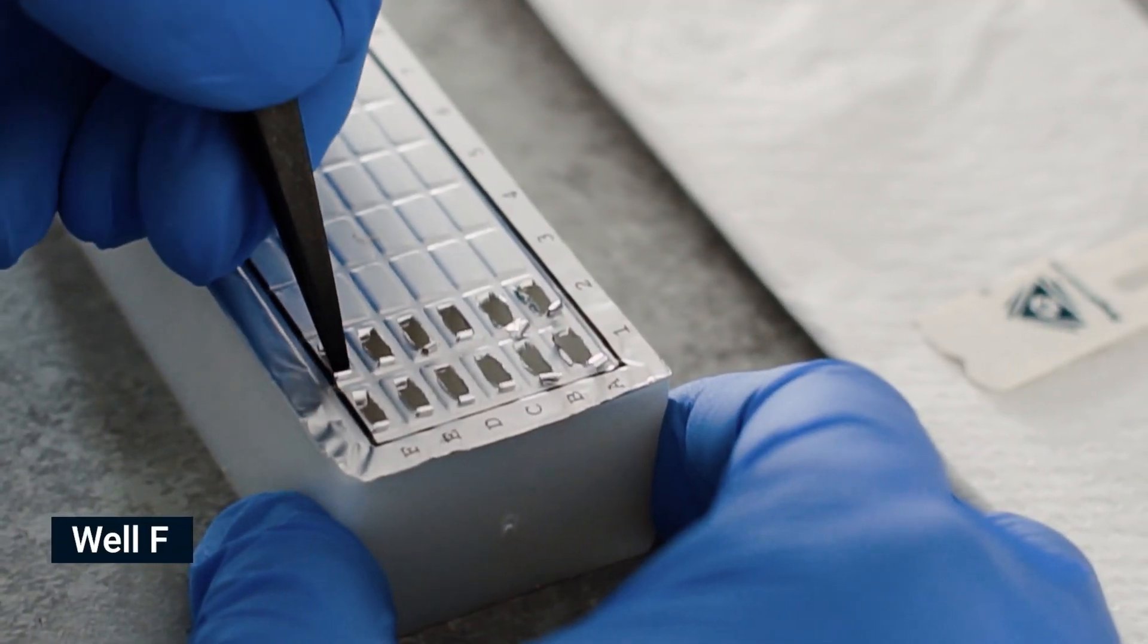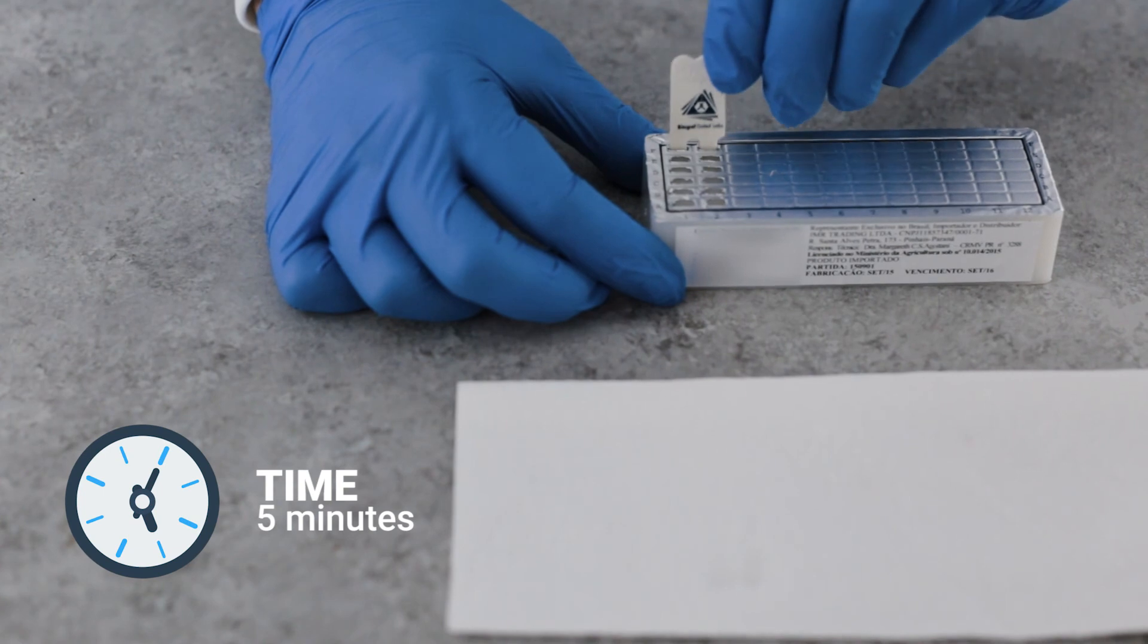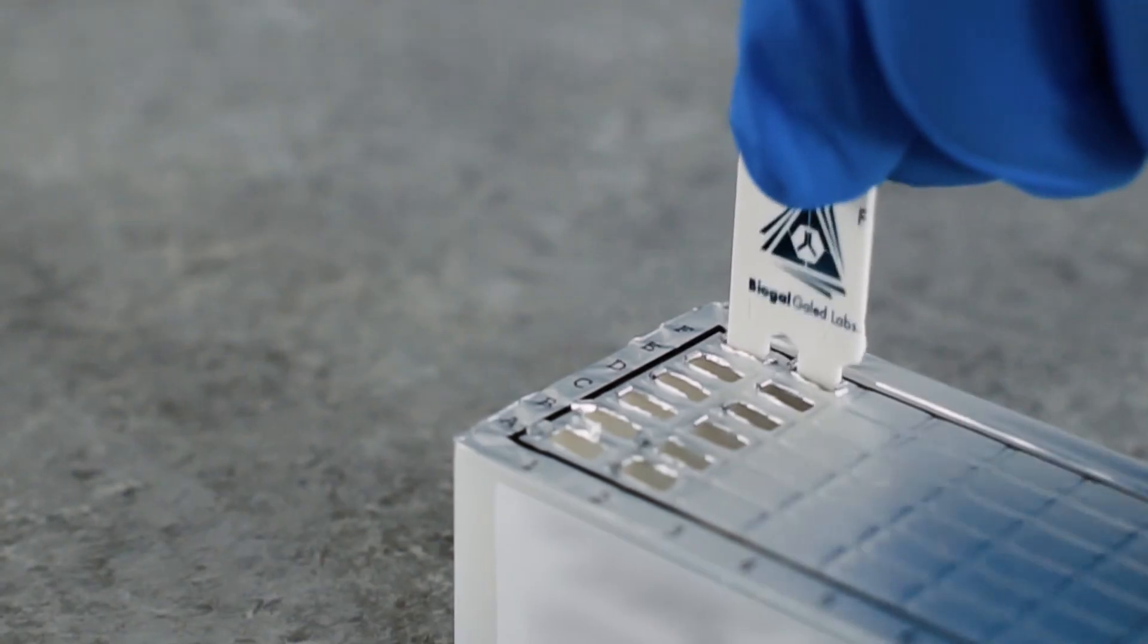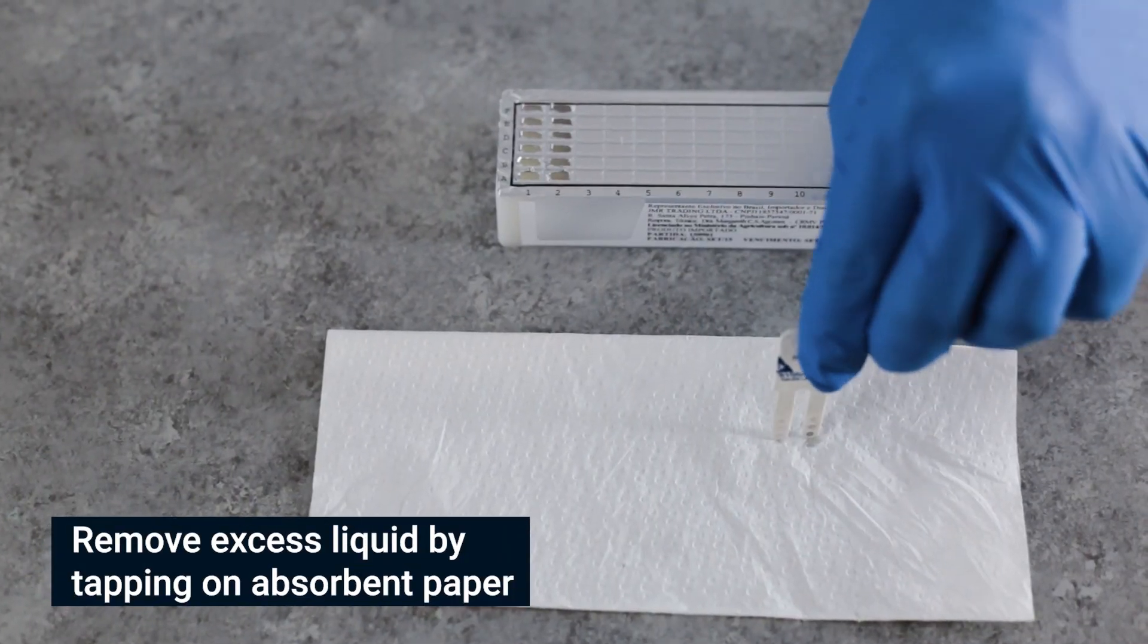Pierce the foil of the next wells in row F. Shake off excess liquid and insert the comb for 5 minutes. Move the teeth at least twice during this step. Remove excess liquid.